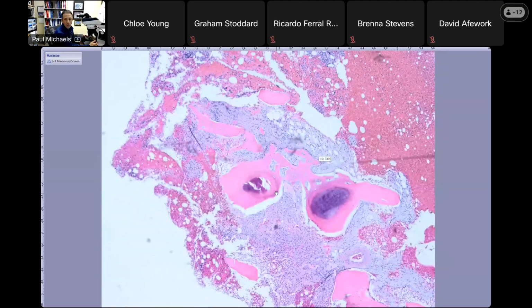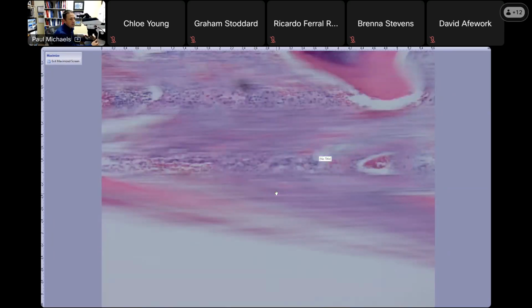So the common tumors that go to bone, there's 5. Breast was one of them. There are different mnemonics: BLT with kosher pickles, so B, breast; L, lung; T, thyroid; K, kidney; P, prostate. So this is the T. This is thyroid. This is follicular carcinoma.